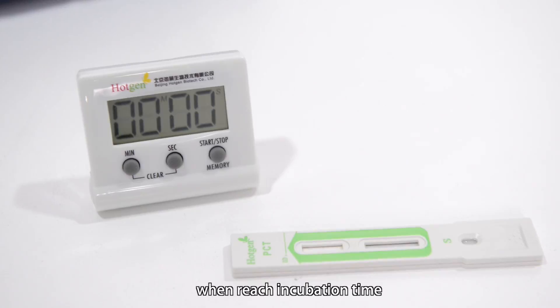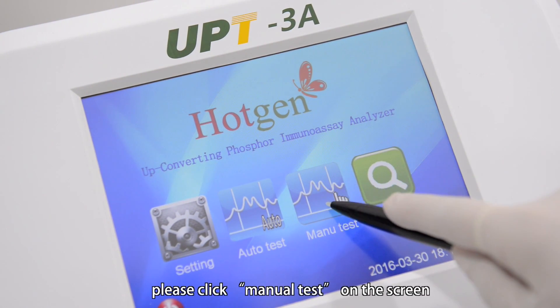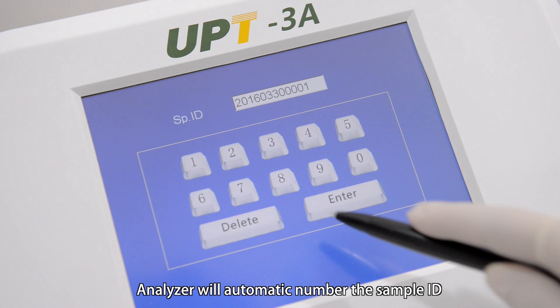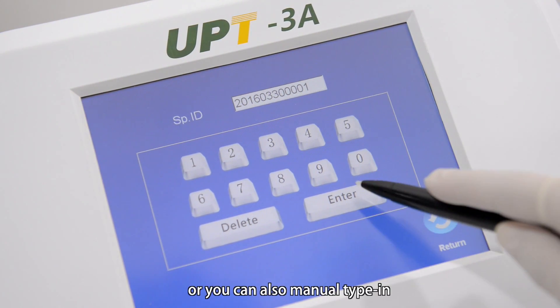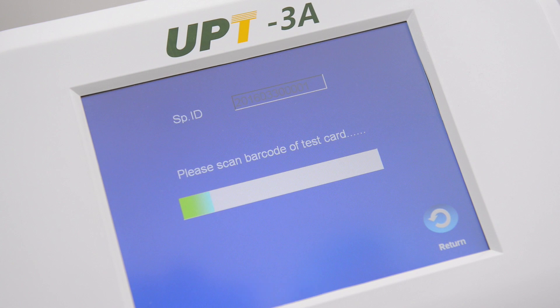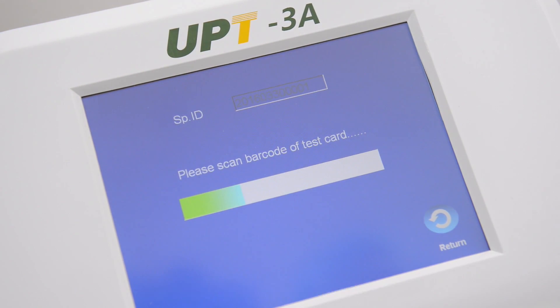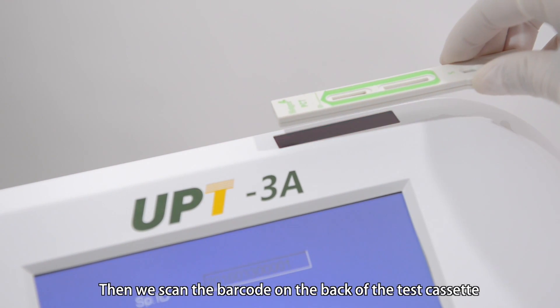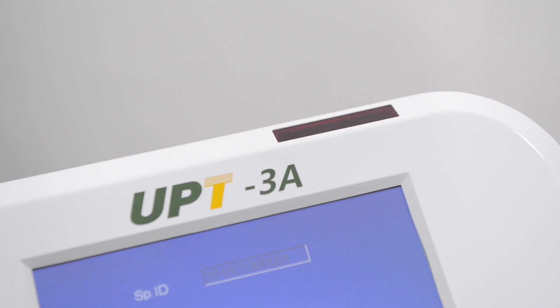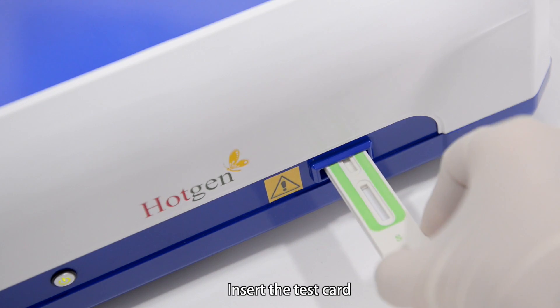When the incubation time is reached, please click menu test on the screen. The analyzer will automatically number the sample ID, or you can also manually type it in. Click enter. The analyzer hints to please scan the barcode, then scan the barcode on the back of the test cassette to read it. After that, the analyzer will hint to please insert the test card. Insert the test card.